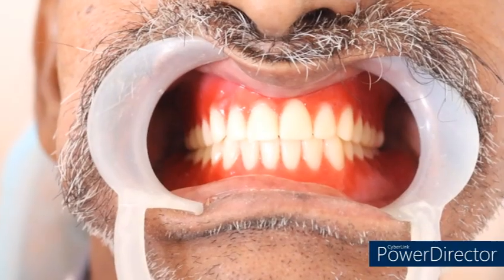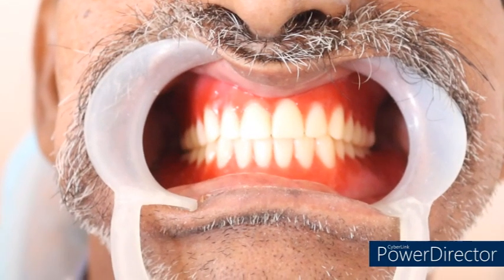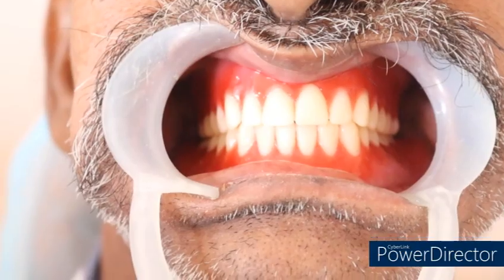So the seventh factor to be assessed is the overall appearance. In the overall appearance, what we have to see is the size of the tooth. It should be selected according to the facial shape, and the position of the tooth should be on the ridge crest, along with the form and the arrangement. It should all be aesthetic and functional.